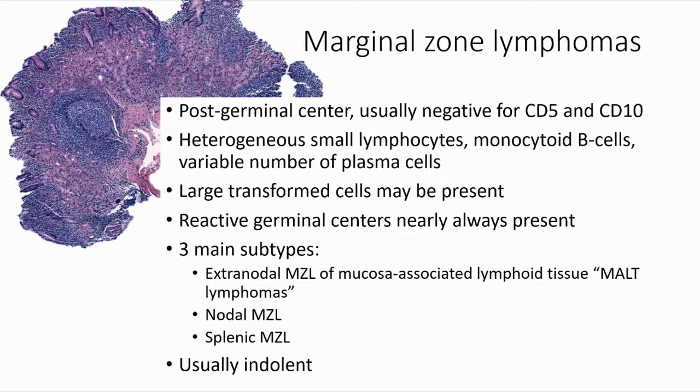Like this case, we really see a really robust increase in lymphocytes here. This looks like a nice case of marginal zone lymphoma, but if it's more subtle, or maybe it's a question of recurrence, it can be helpful to use that dual stain where you can see the B cells and the plasma cells together, whether or not they're clonal. But especially in the stomach, where you shouldn't normally have a whole lot of lymphoid tissue, morphology, and obviously looking for H. pylori carefully, are all extremely helpful in that setting.